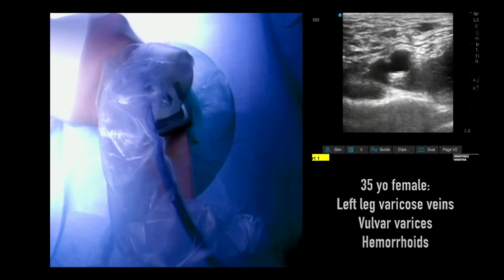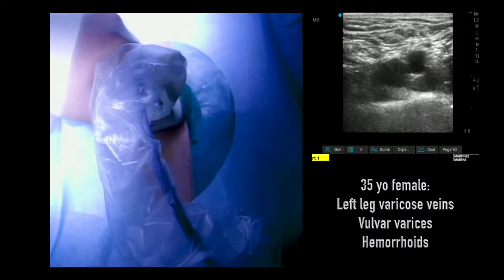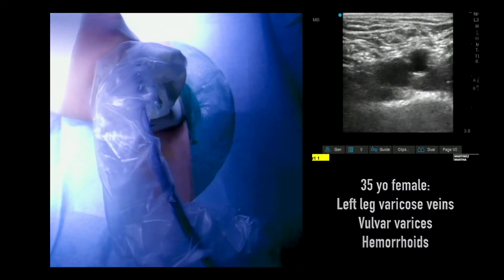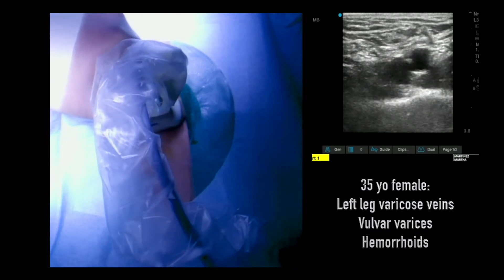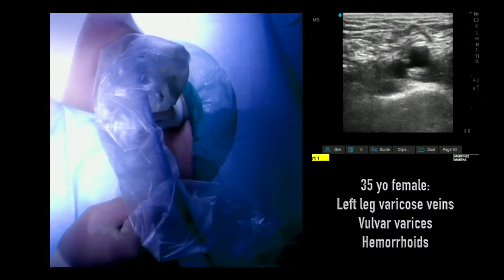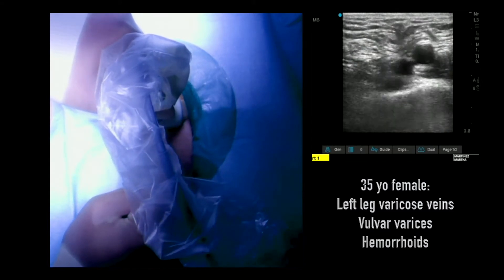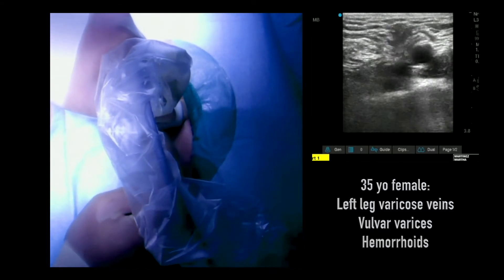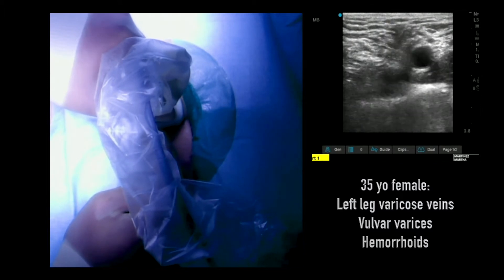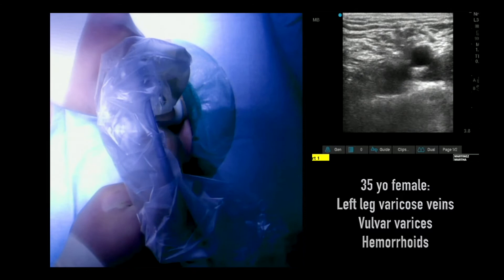Here we're performing an ascending venogram through a left femoral approach. We do all access using ultrasound guidance. Here's a nice depiction of the pulsatile artery with the vein medial to this. It's important always to be able to see the tip of the needle — you can see the needle compressing the tissue and then accessing the vein directly. We always use a micropuncture needle, micropuncture sheath, and a micropuncture wire.